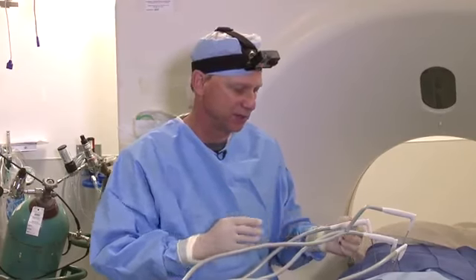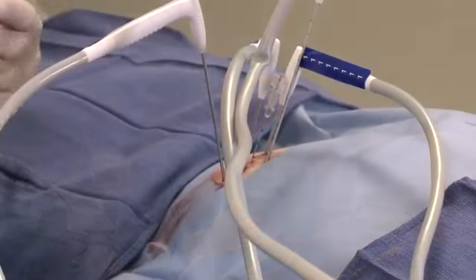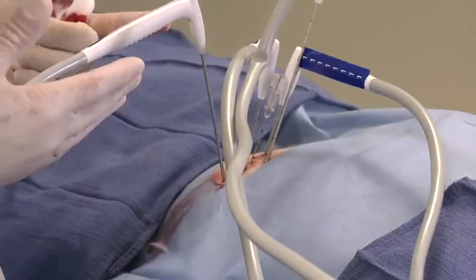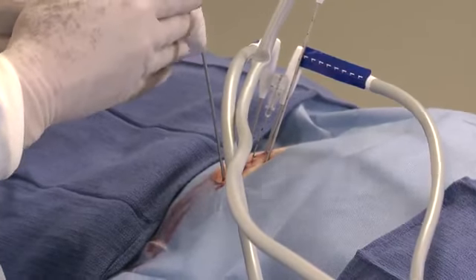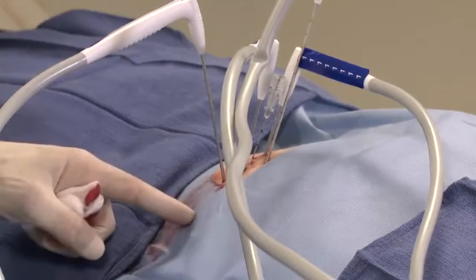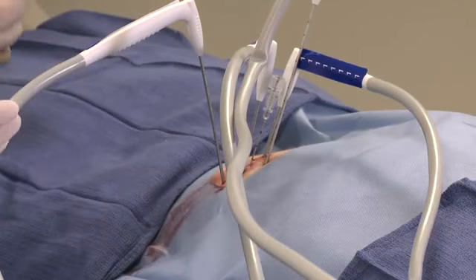I just want to mention something about the stick mode. The stick mode is an argon cycle. It's a brief cycle. When it gets down to -4 degrees, the argon will turn on briefly enough to keep it negative and keep it stuck or frozen in place. I'm not using the stick cycle in this case because the probes are deep and I have gravity working for me. But if they were superficial or the probes were this way, I would use the stick cycle.